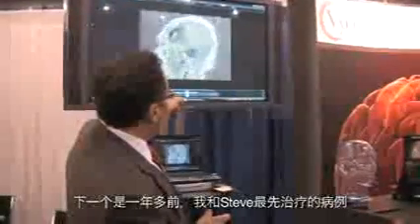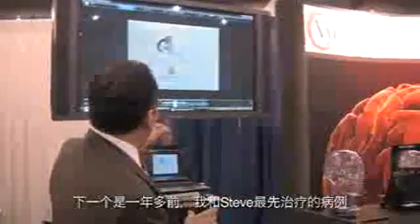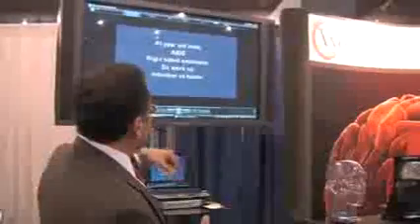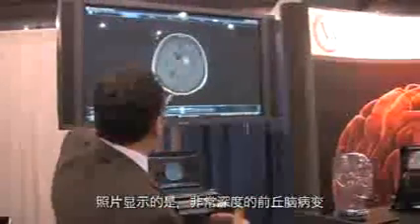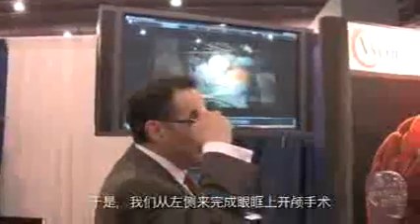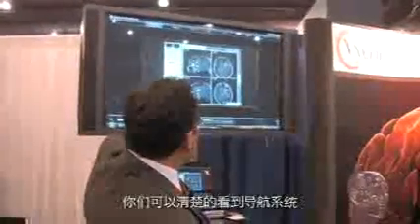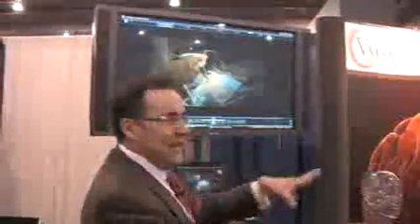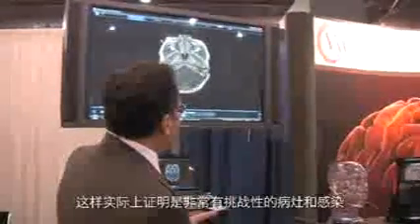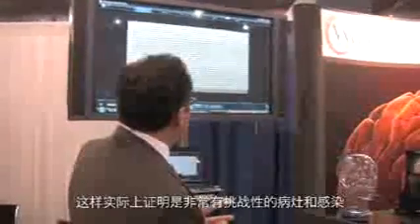The next case was actually the very first case that I did with Steve over a year ago, when we had another patient. This is a 41-year-old man with history of AIDS, right-sided weakness. Workup showed a lesion, very deep anterior thalamic. You can see right here into the insula, dominant hemisphere. Very challenging lesions to get into. I couldn't do an awake craniotomy. We needed to obtain tissue, so we ended up doing a supraorbital craniotomy, going through the left side, a supraciliary approach, right through the eyebrow. We came down with the surgical navigation. You can see the navigation system, same setup with the Greenberg retractor, and you can see the post-op. This actually turned out to be a very challenging type of lesion and infection. So we did a very good thorough resection.